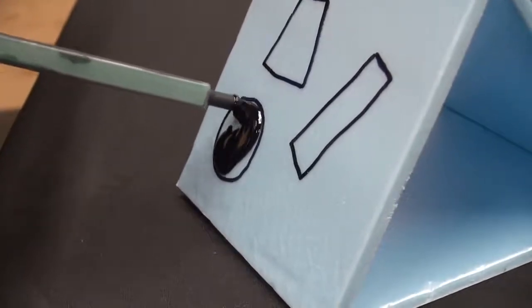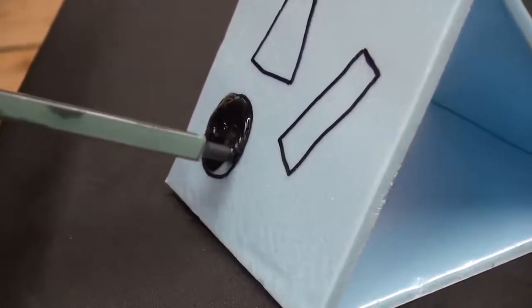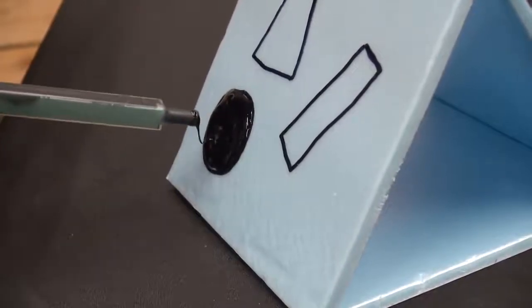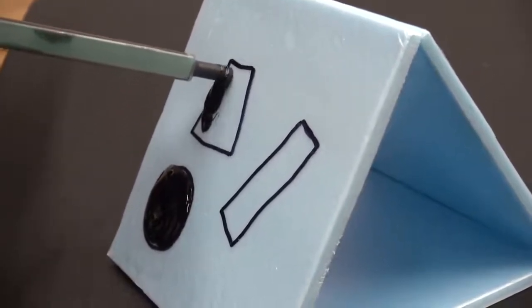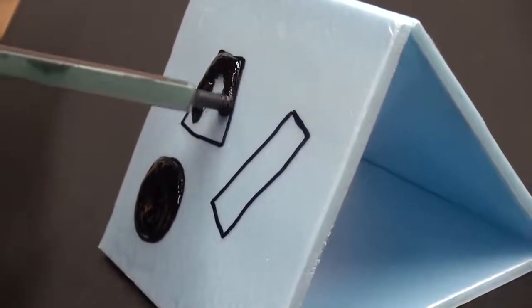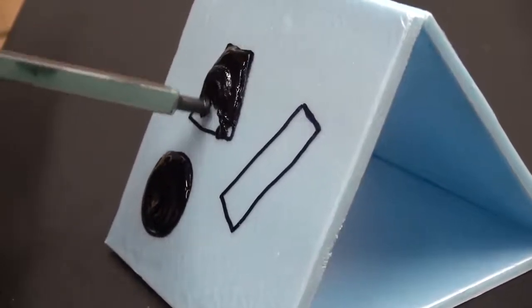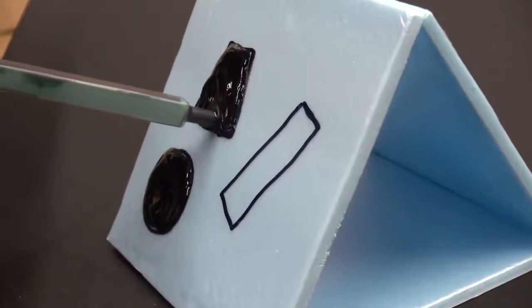And so we can fill in pretty much any shape just using the control of the mixing tip and that circular motion. So if the material is fairly runny, it's very hot, you just stay in one place and you keep stirring until the material stops moving. And it doesn't really matter where you start, but as long as you keep that material connected to the flow, or I should say the mixing tip should always be connected. In other words, we don't want material to fall out of the mixing tip. We want to keep it connected to the flow and keep stirring it. And that really gives us the control to fill in any shape we want.